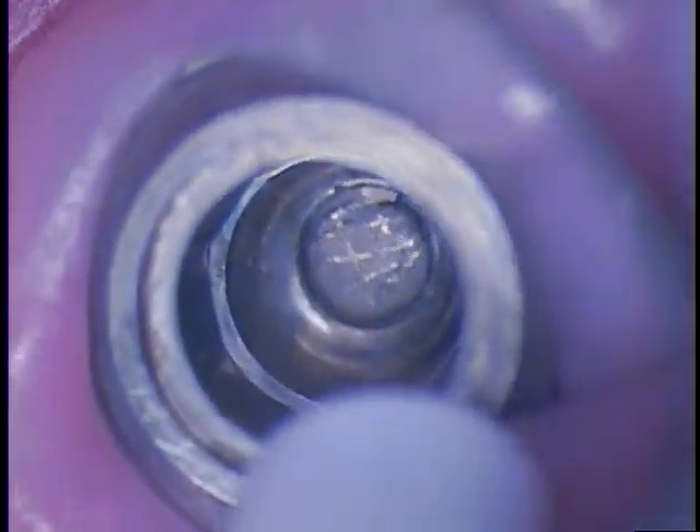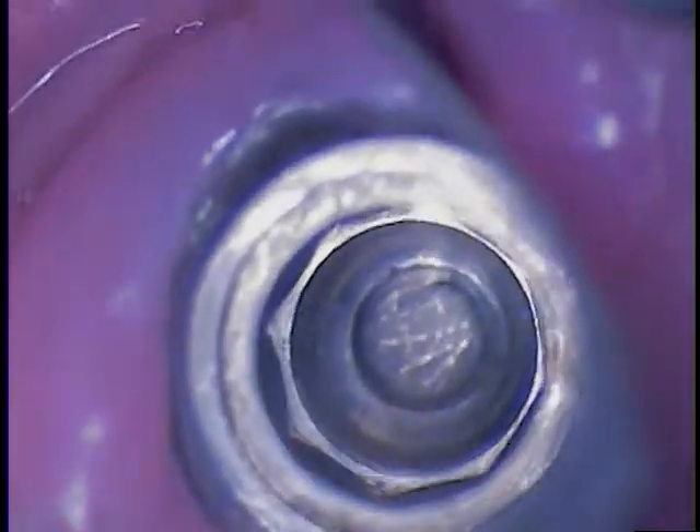The question is whether that's enough to prevent this fragment from coming up. I'm going to continue to dry here and just test it so I can classify this. I'm going to pre-soak the area and check for mobility, then we can give a final diagnosis. I'm looking around and visualizing, checking to see if there's any damage to the inside of the top portion of this fixture. I see only one mechanical area of concern, but it's very small and minute.